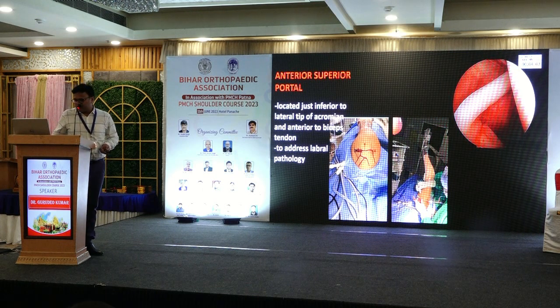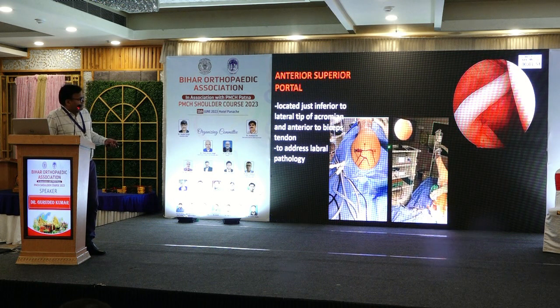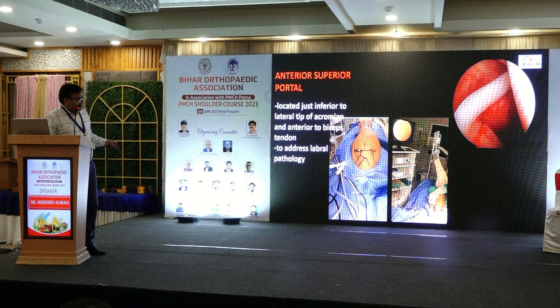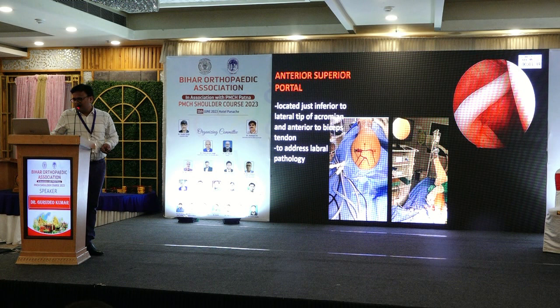The anterosuperior portal is just lateral to the acromion process, in the line of the coracoacromial ligament. It is made by the outside-in technique with an 18 number needle, viewing through the posterior portal with the scope.